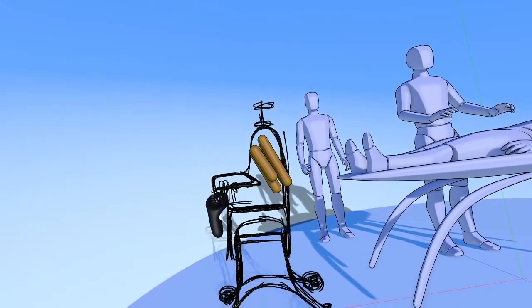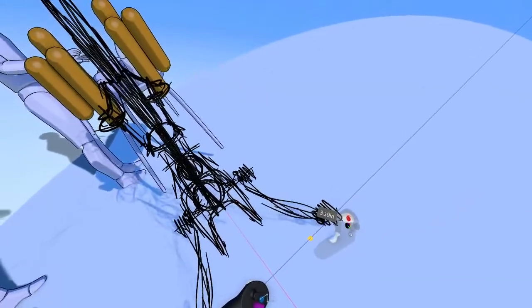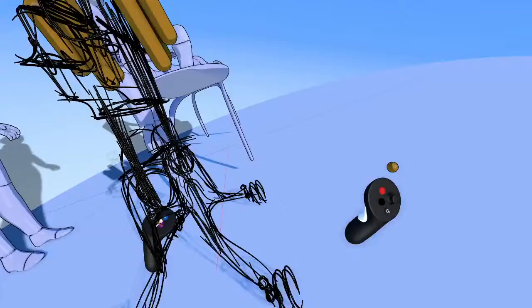But, you know, this is good for now. All right, and as far as the legs go, we can just reach in here and stretch them out like that. But, again, compactability. So let's group these sketch lines together.